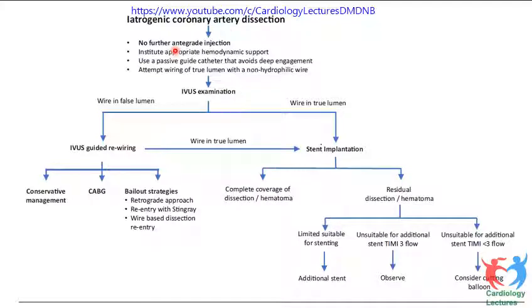try to avoid further antegrade injection into the same guide. So be slow on injecting. Only if there is a necessity, give a small injection. Or you put some catheter, like an over-the-wire balloon or some microcatheter, and just inject slowly beyond the dissection.